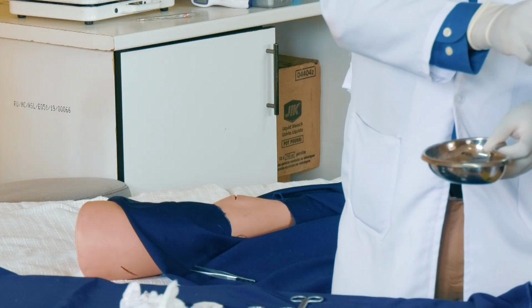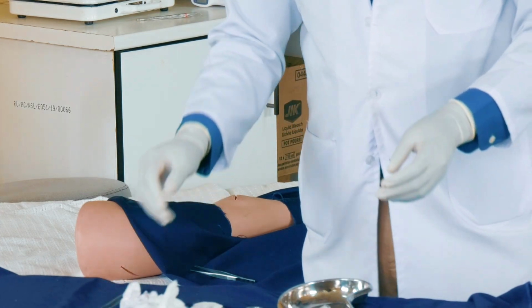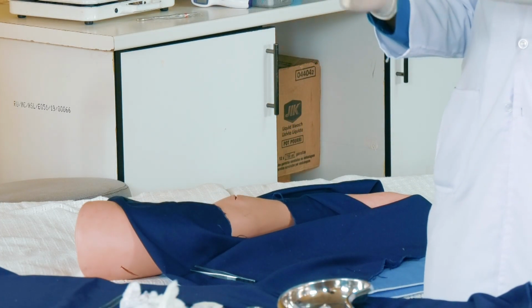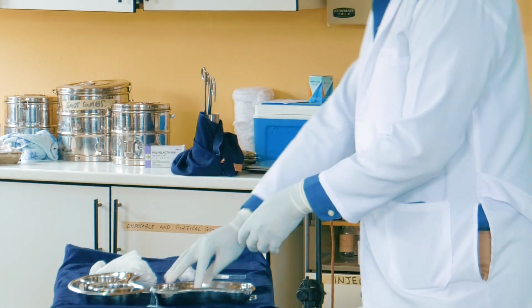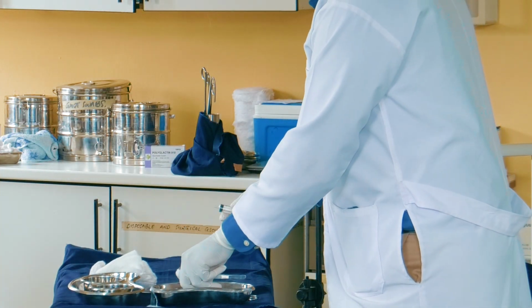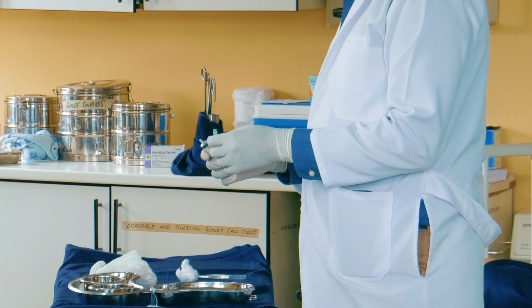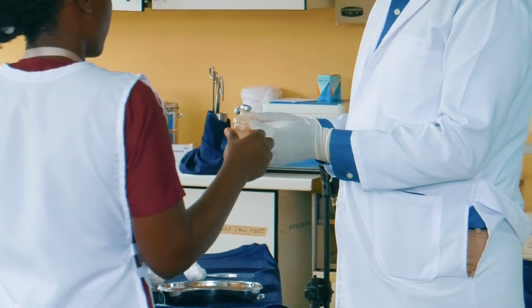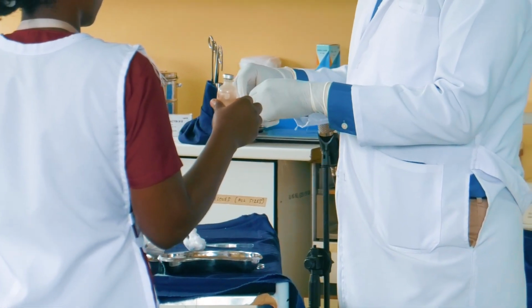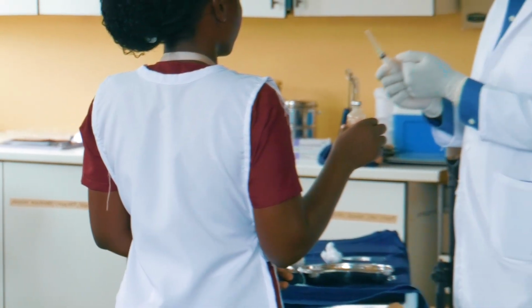Then get lignocaine. The drug is lignocaine that we are using. Before she gives me, she has to show me this is lignocaine. I'll check the expiry date, so that after giving the patient, if the patient reacts, we don't start saying she gave me something else. How do I receive something else? I'm responsible for everything. She has to show me that this is lignocaine.